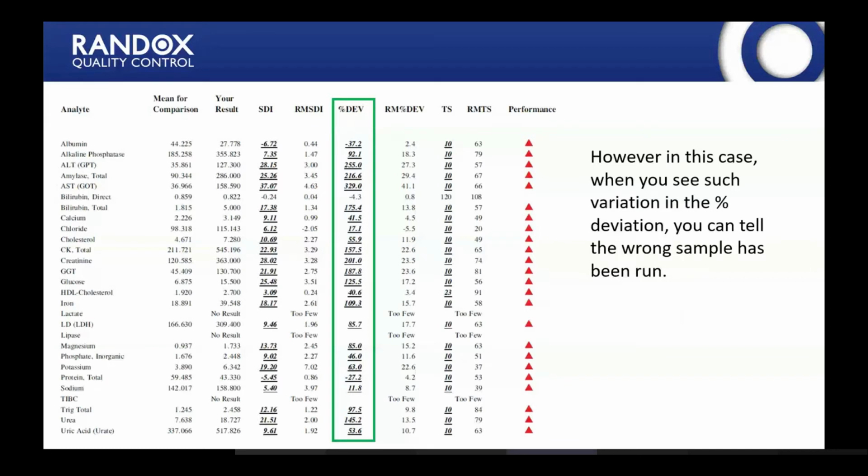So this is the other example. Stephen had mentioned that I would be showing you the two examples. The previous one was a reconstitution error, and this is where the lab has submitted the results for the wrong sample. In this instance, again, we have all the red triangles. So we know, again, this is likely to be a sample issue. We want to look at our percentage deviations, and this time you can see that the deviations are all different. We start off with -37, we'll go up to 255, on up to 329, and back down to -4.3.